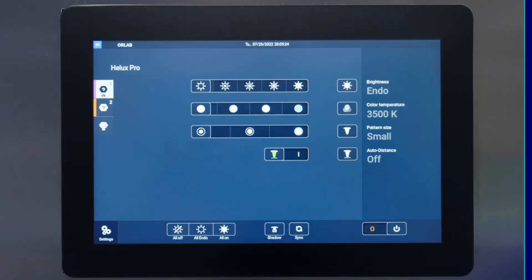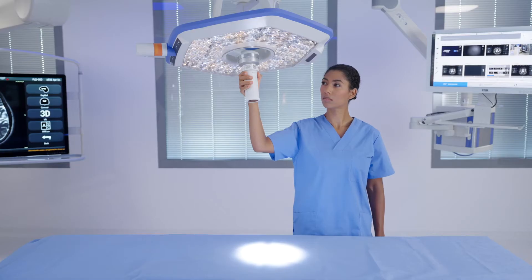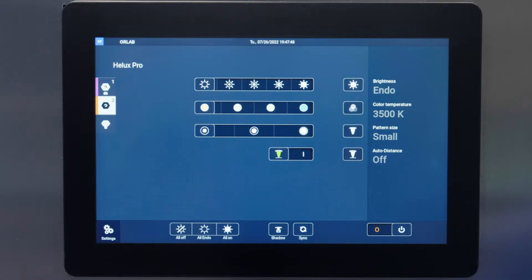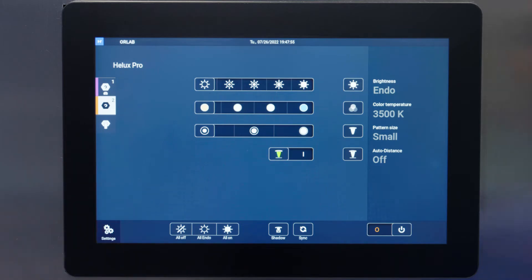The light can be operated at the wall control unit, directly on the light head, or via the sterile light control or SLC handle, which we will learn more about later. The wall control functions include a quick access bar that allows you to control up to three Helux Pro light heads and the optional 4K camera.